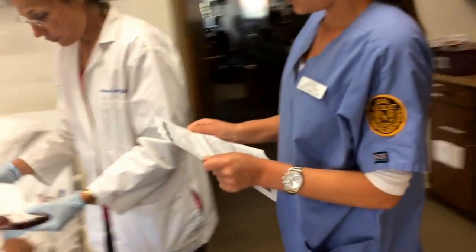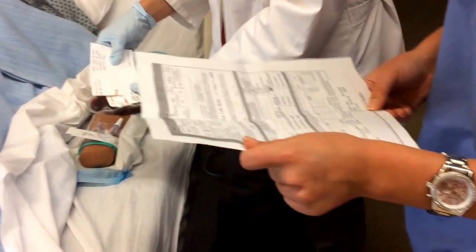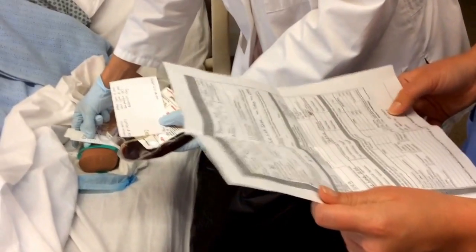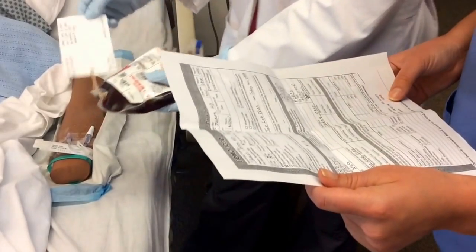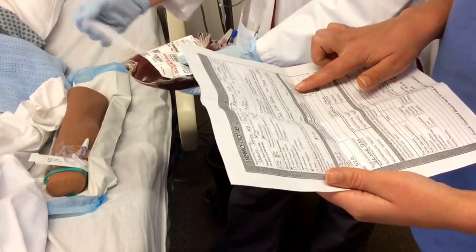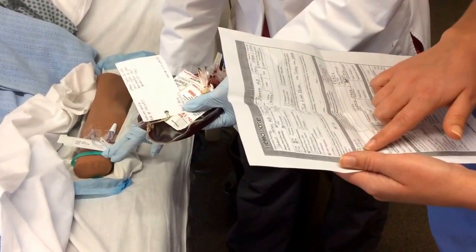Okay. So first we have John Smith. John Smith, and you can read that to me down here. Okay. John Smith. All right. And his date of birth is 8/7/78. 8778. Okay. His medical record number is 123457. 123457. Very good. Okay, we have unit number 0049093. 0049093. Okay, we have blood band number 0002009.